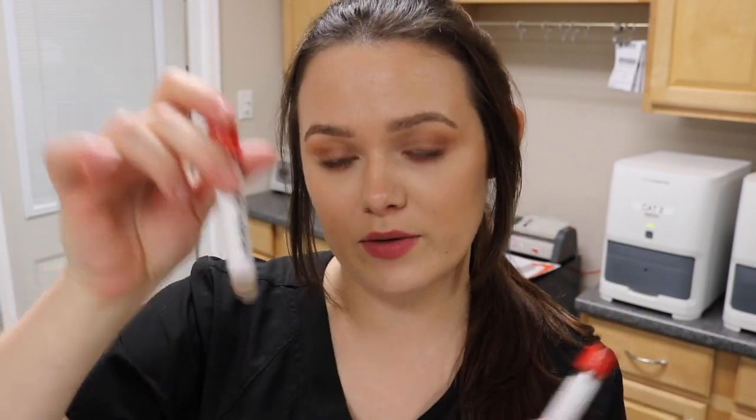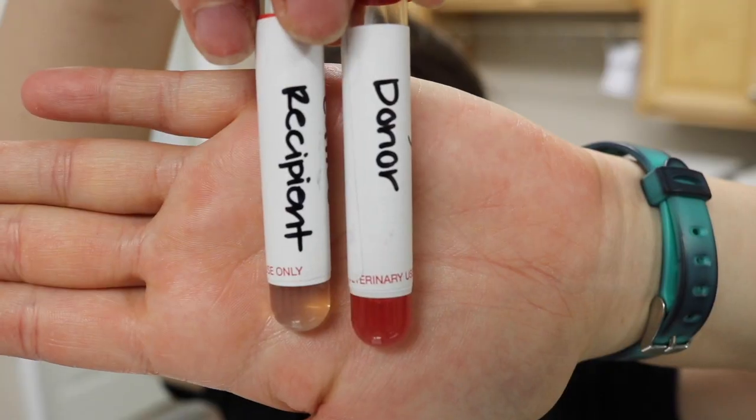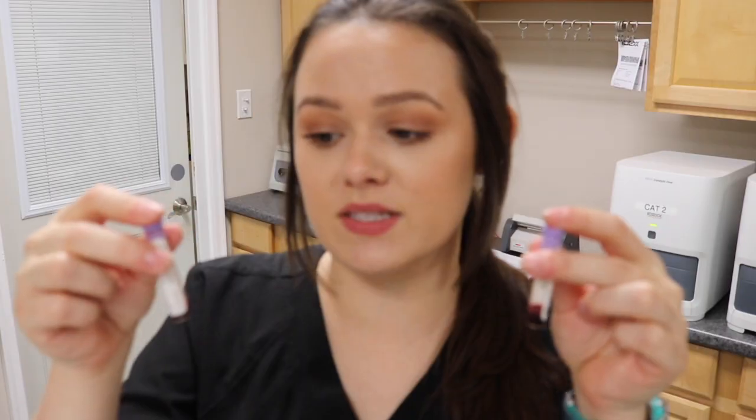I'm going to be performing a cross-match agglutination test today. I have two different samples: my donor and my recipient. This blood has been centrifuged and I took the serum and separated it into two different tubes. I also have an EDTA sample from the donor and the recipient that has also been centrifuged.